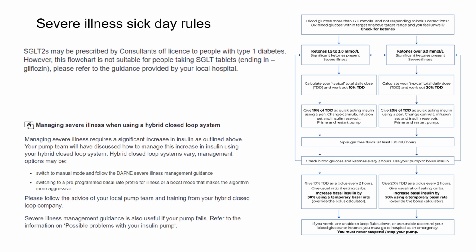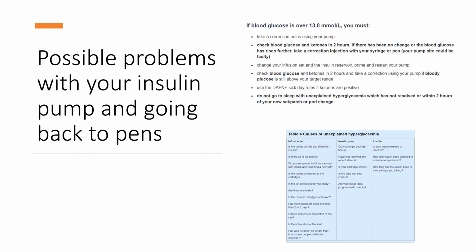Group video support call discussions around illness management can be based around these scenarios. Sick day rules are followed by a recap of what to do if there is a problem with your pump, linking this information to illness management sick day rules and including 2 character-based scenarios based on problems with the pump.